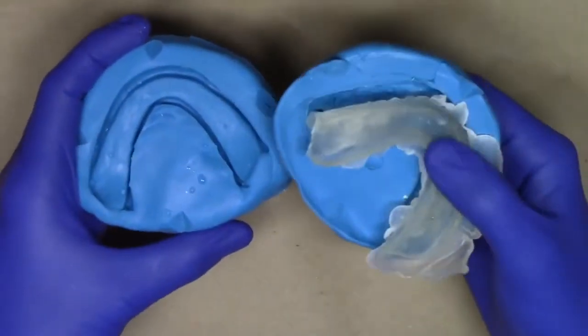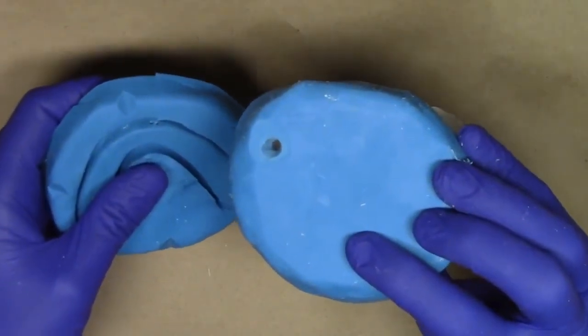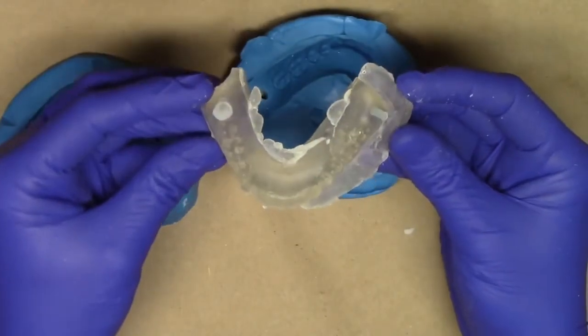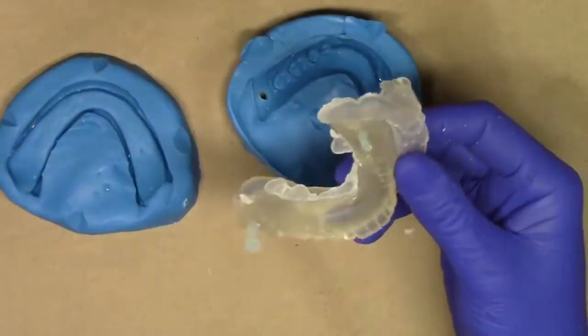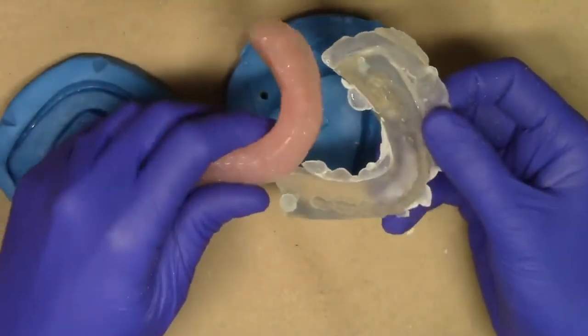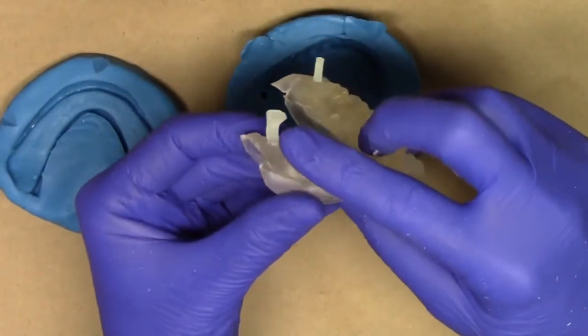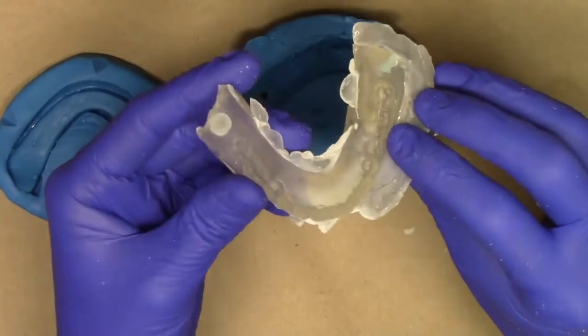So now at this point I've removed the top portion of where the injection sprues are, and I can very easily remove my duplicate denture. As you see here, this is a clear version of my patient's existing complete denture prior to cleaning up. But the key is I want to be able to see these little sprue channels, and that allows this to get a very nice cure.